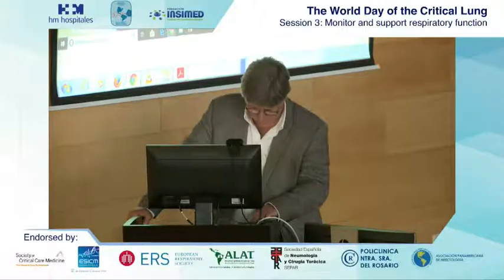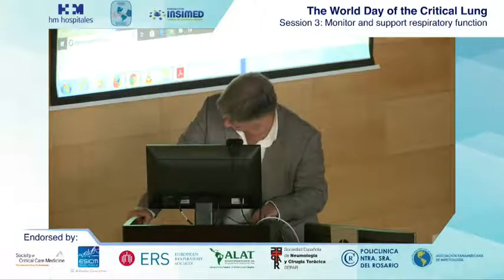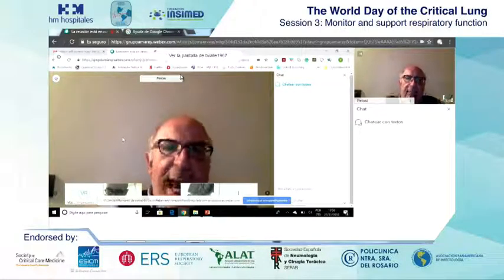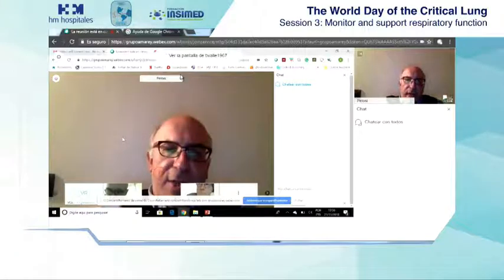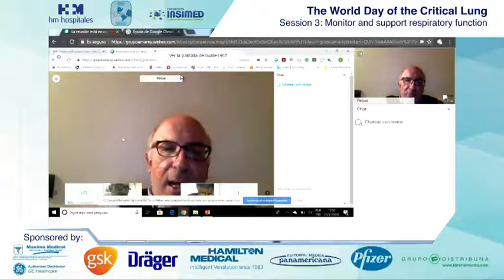And I think also that mechanical power, as I showed you, might be a further advancement, because it puts together the driving pressure and the possible role of respiratory rate. And I showed you that in a large population of patients, we found a quite good association with mortality. Of course, this has to be demonstrated in a prospective randomized trial.